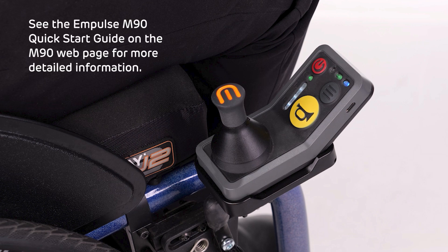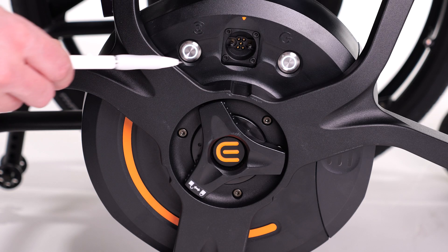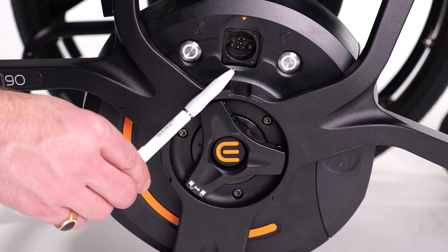For more information or details on the controller LEDs, please see the quick start guide document that can be found on the M90 web page. The M90 wheels have two LED buttons that will be used during the calibration process, as well as displaying whether the wheels are on and when they are charging. The charging port for the M90 can be found here.